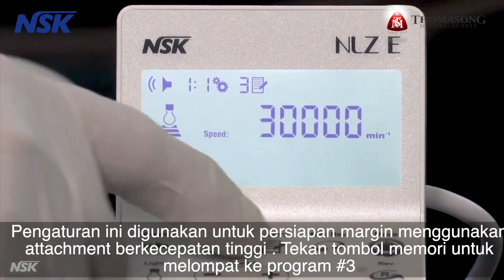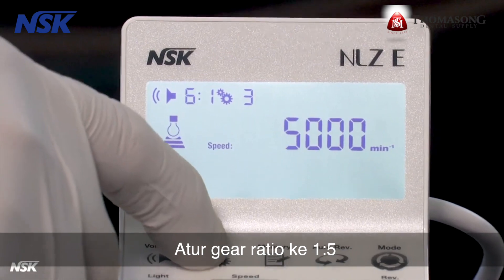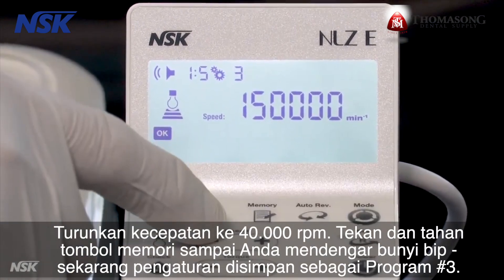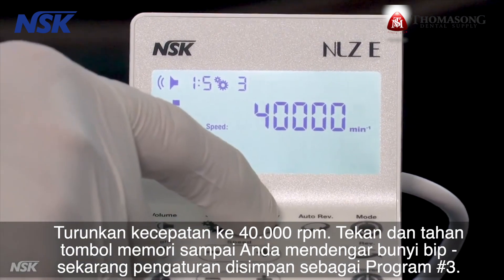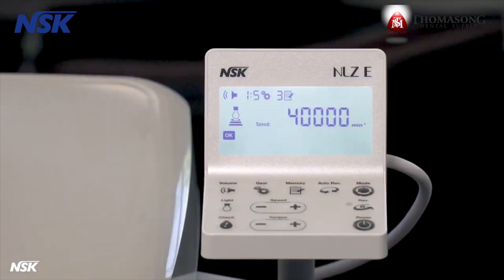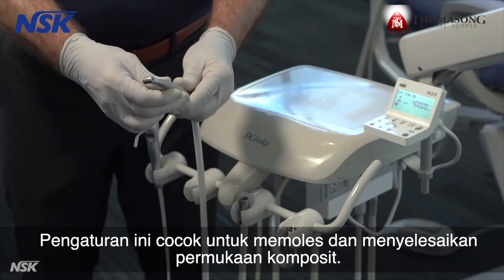Press the memory button to jump to program number three. Set the gear ratio to one to five and dial down the speed to 40,000 RPM. Press and hold the memory button until you hear a beep — the setting is now stored as program number three. This setting is suitable for polishing and finishing the surface of composite.